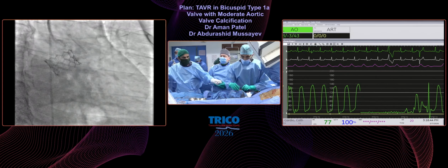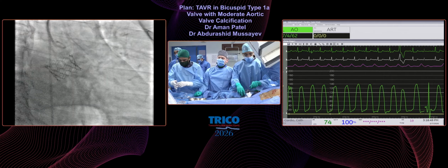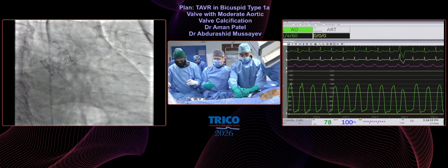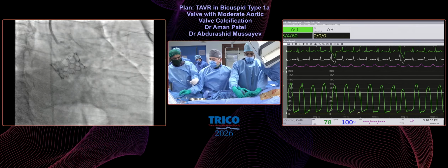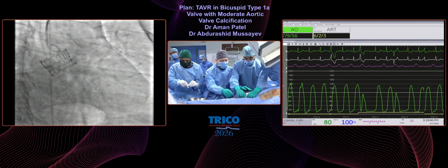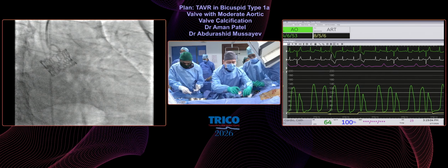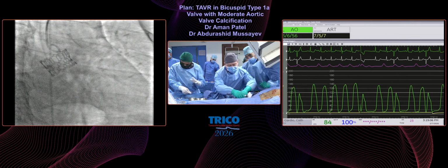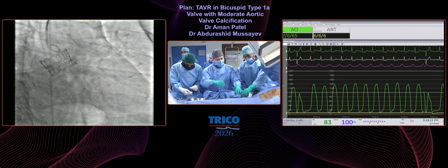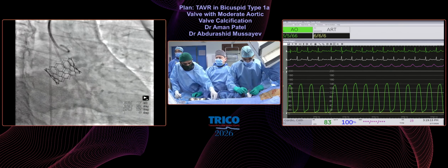It's a beautiful result. Every TAVR I see, I just think, not long ago, these patients were in the hospital, minimum one week, recovering at home three months, and older patients would not get this treatment. Now patients will go home same day, next day with a new valve. It's truly amazing technology and a fantastic result. Look at that: perfect positioning, no AR, conduction normal, a very greatly done case. Well done. Thank you, sir.